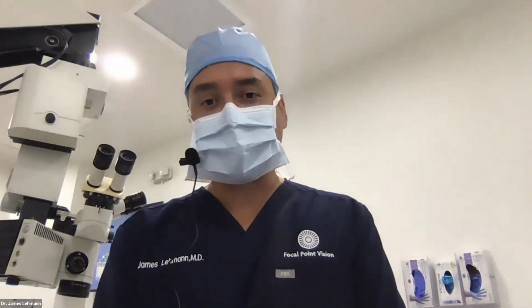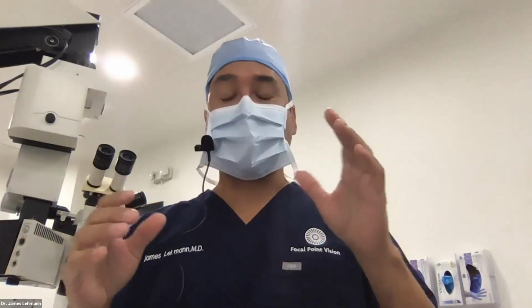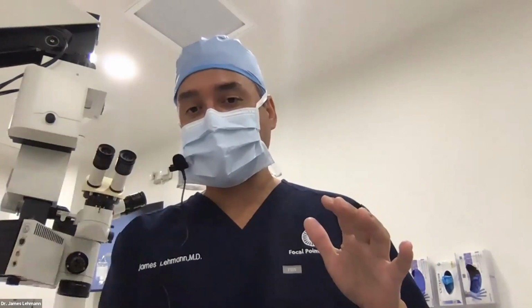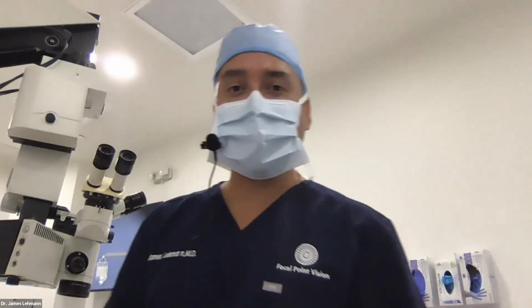And then Dr. Jesus Mate Corena asked, do you remove the OVD from behind the IOL as routine practice? When it's a cohesive, you don't necessarily have to. It will come up from behind. If it's a dispersive, you definitely have to go behind and get it out. So generally, I don't have to do that. I can see the way that the chamber flattens and the way the lens kind of comes up, that there's nothing behind it. Next question is, what are the key points of Femto-phaco in a highly myopic patient?